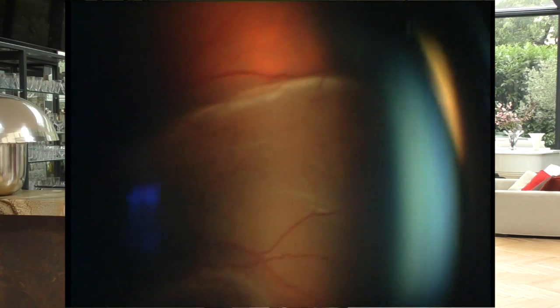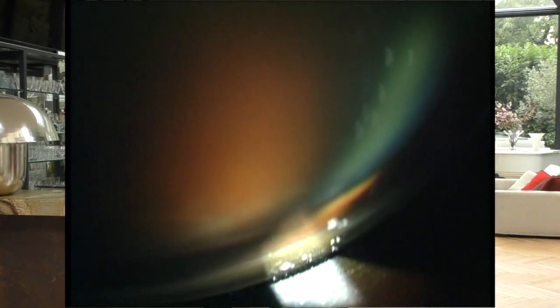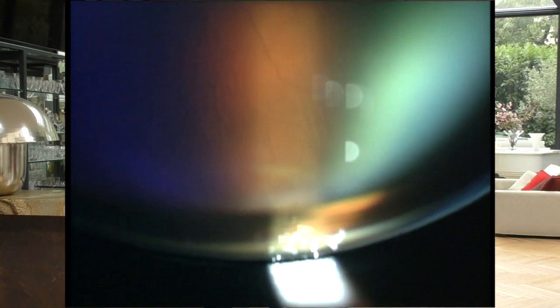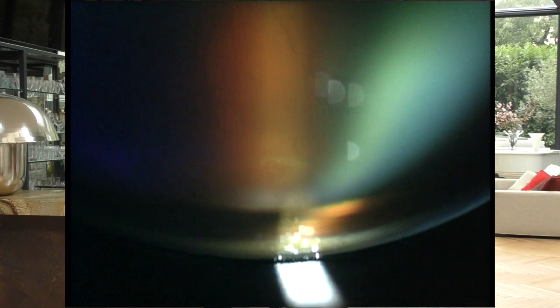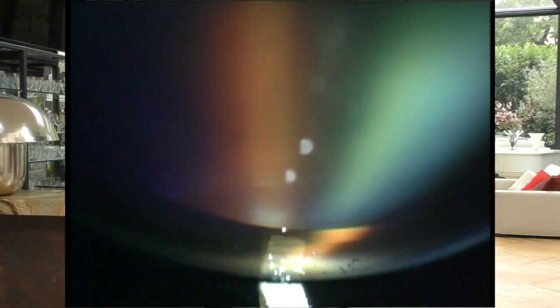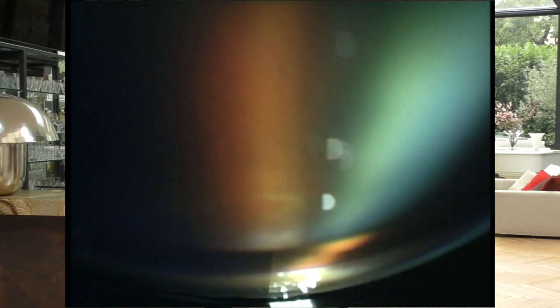Let's see what happened in the same phakic patient. Immediately we see that we have this beautiful overall appreciation provided by wide-field lenses. We immediately see that the connection zone goes back up to 9–10 o'clock. And we can see the vitreous base. But the tears are identified with less security because they are located at the limit of the exploration field of the lens. It would be hard to identify so exactly the 5 tears seen earlier. On the other hand, we always benefit from the progressive examination millimeter by millimeter.